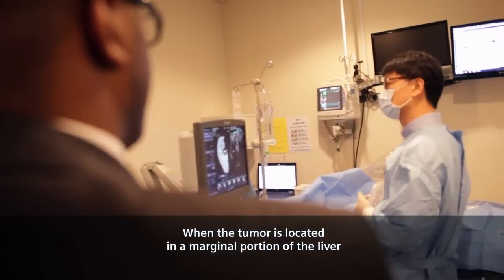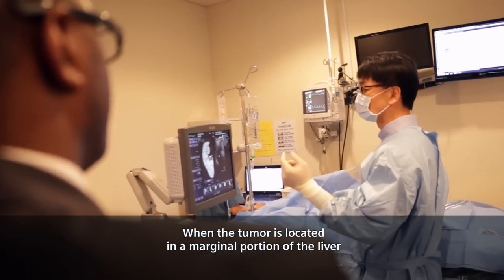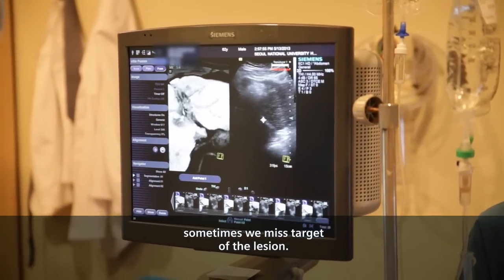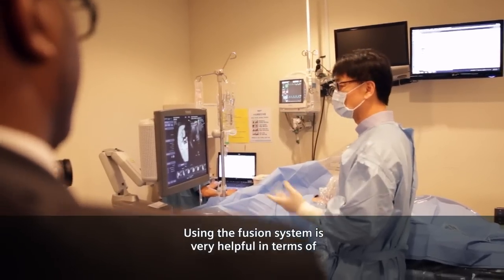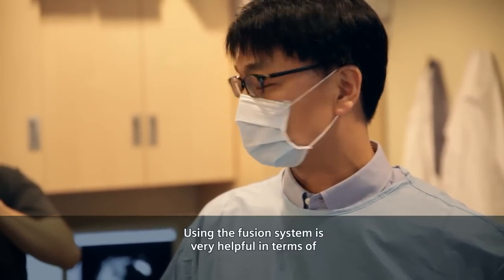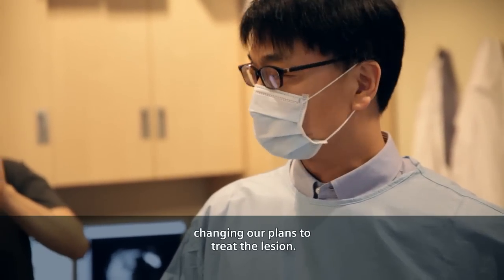When the tumor is located in the marginal portion of the liver, sometimes we mistarget the lesion. Using the fusion system is very helpful in terms of correctly placing the needle.